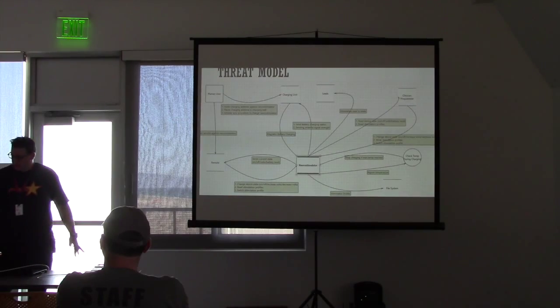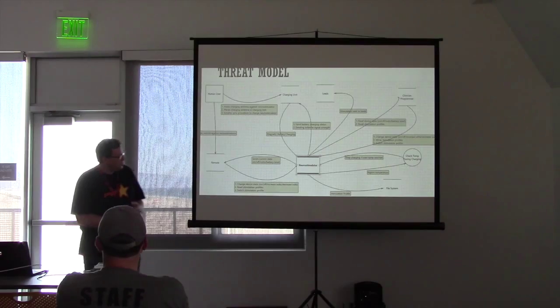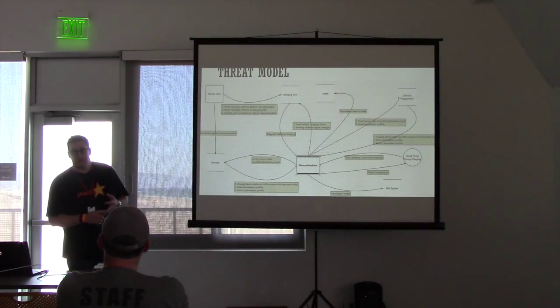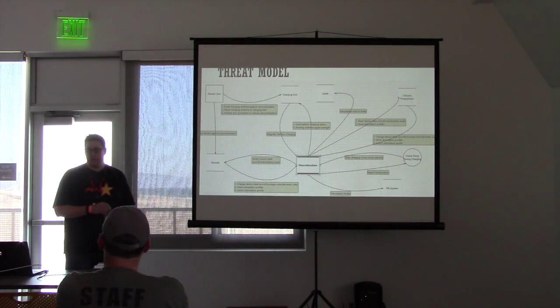And so from this perspective here, this device shows battery strength. It shows whether it's on or off, how many volts, what program you're running, A, B, or C, and other information.